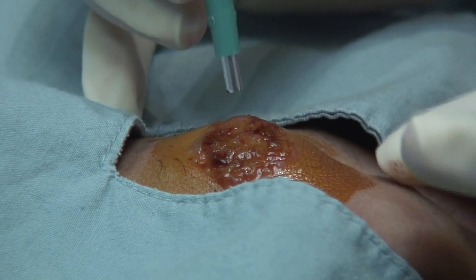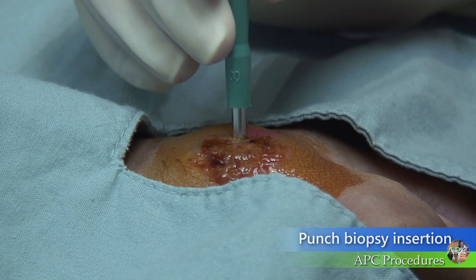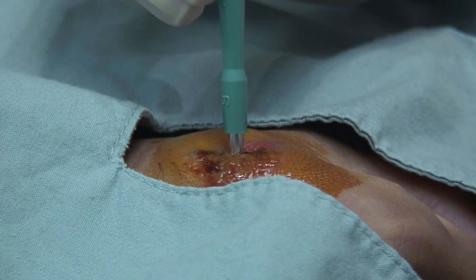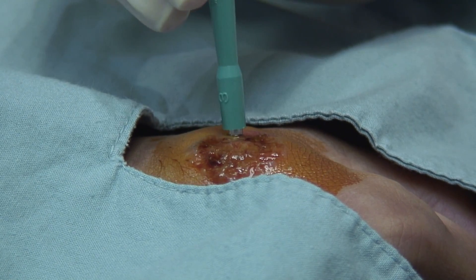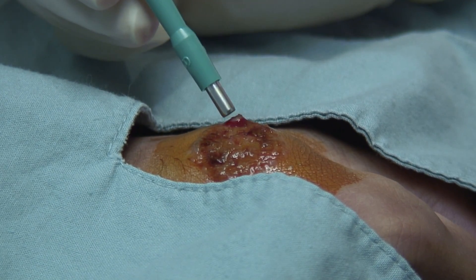Choose the appropriate size punch biopsy instrument, from 2 to 5 mm in size. Press the punch instrument vertically into the skin and rotate it to cut through the skin into the subcutaneous fat. A decrease in resistance should be felt at the point where the dermis is completely penetrated.